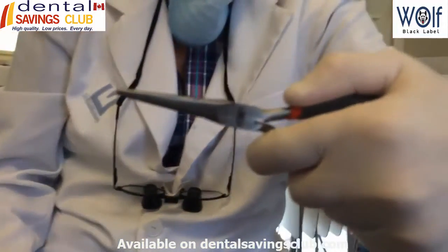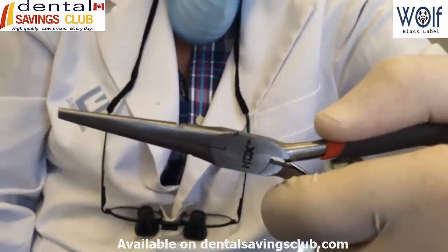Pretty good. That's a perfect depth cut for a crown.